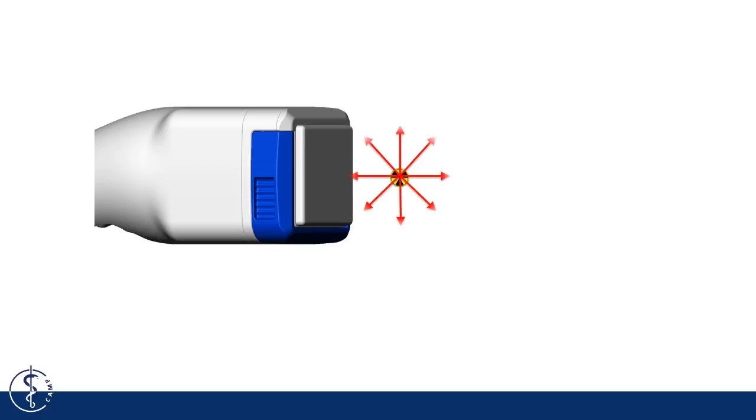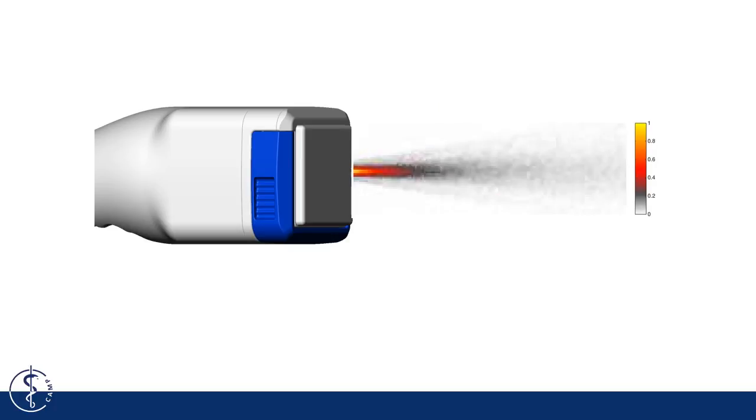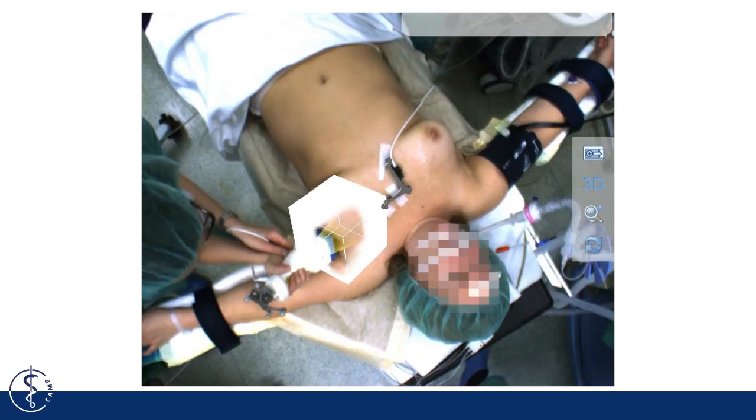However, a much more accurate modeling and calibration of the camera setup is necessary to fully exploit the detector's possibilities. In an exhaustive manner, a radioactive point source is positioned at different locations in a regular grid, and the counts for each of the camera's pixels is recorded. This is then used to generate a 3D probability map for each pixel, telling us where in space a detected photon could have come from.